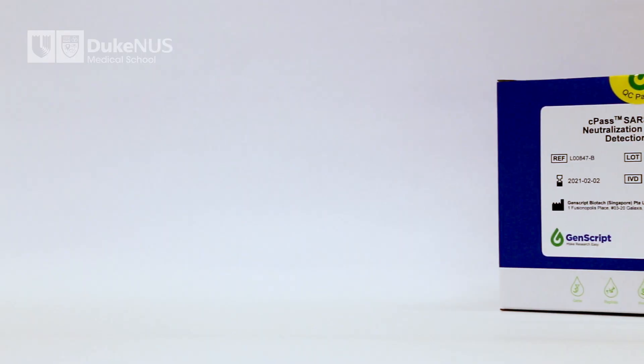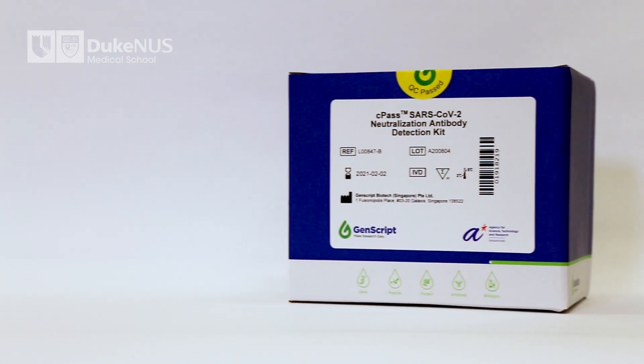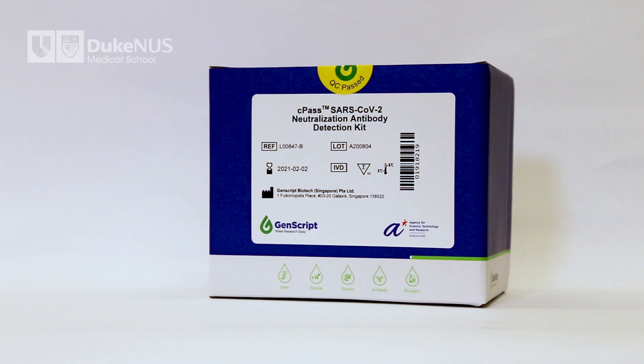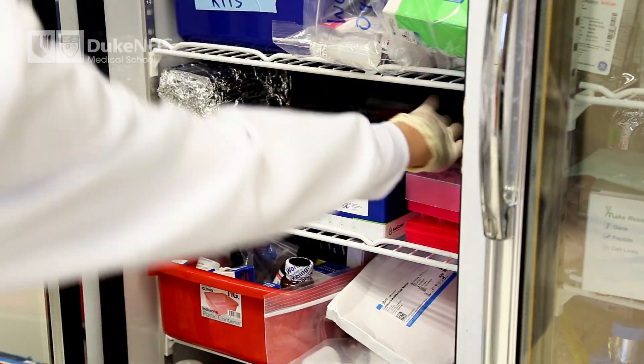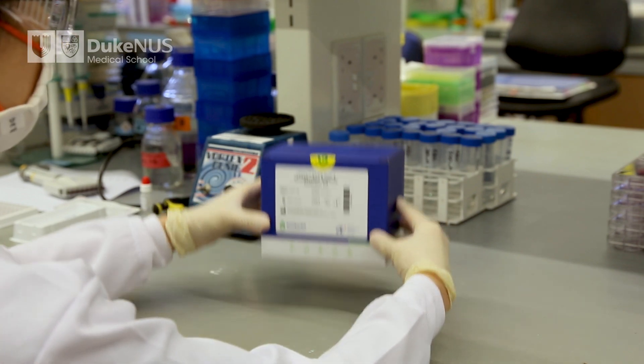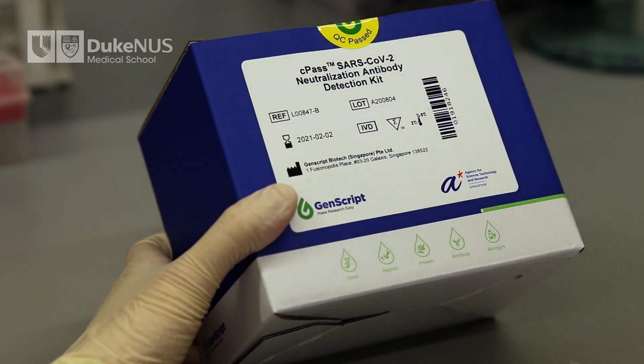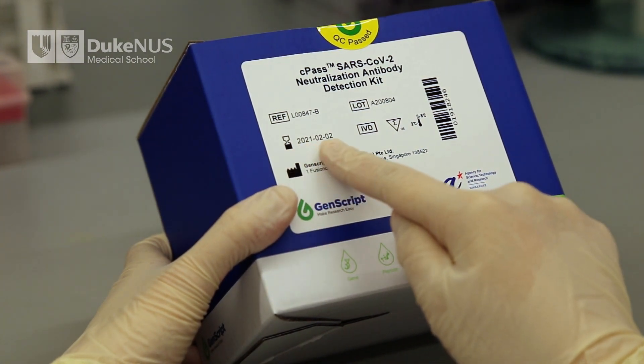The CPAS kit comes in the form of a box that should be kept between 2 to 8 degrees Celsius. Only take the box out of the refrigerator when you are ready to use it. Make sure that the box is properly sealed and has no external damages. Check the expiry date of the box and make sure it has not yet expired.